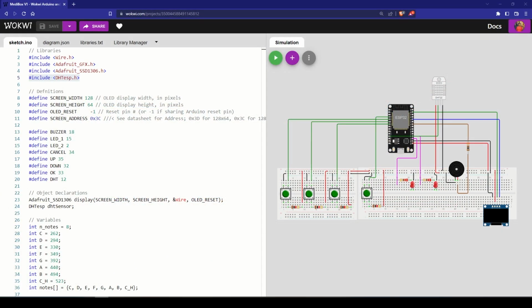This is the simulation that we made back in day 3 for the MediBox. In this simulation, we use the DHT22 sensor. Since now we are using the DHT11, we will have to make some modifications.